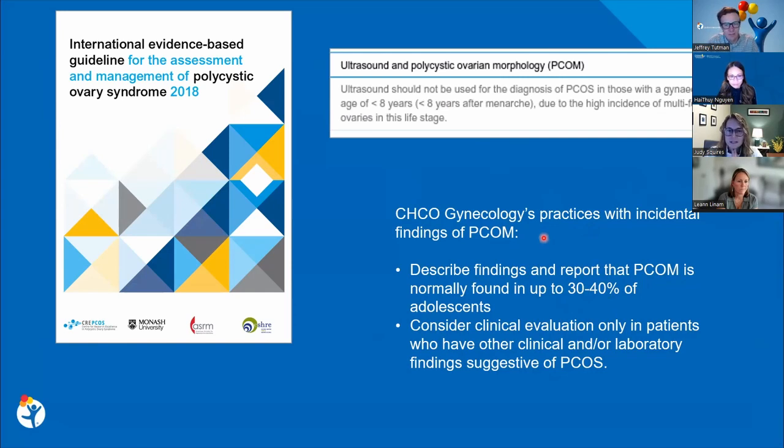Similar. I think the clinical setting is super important in this population, especially. What's interesting in the adults, I think all of the criteria are based on transvaginal ultrasound imaging also. So clearly we need to better define this in the pediatric population, or potentially consider adopting some of the adult criteria into our imaging. But I still think this is another one of those collaborative approach diagnoses. It's important to report it, but not say compatible with, this is definitely PCOS.